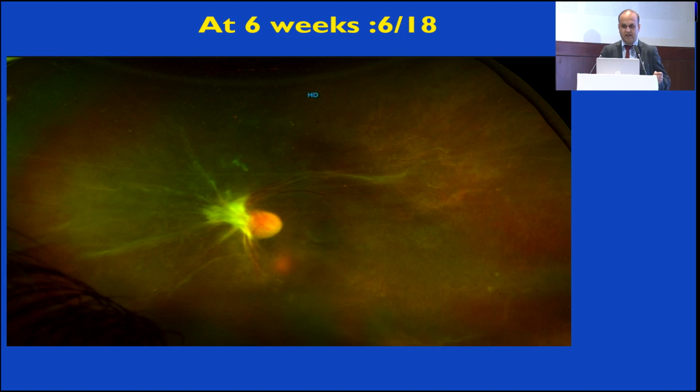So in a nutshell, endoscopy allows for a much earlier intervention in eyes which have opaque media, also helps in removing these foreign bodies, and allows us an opportunity to take care of our patients at a much earlier time than what we could have done if we were waiting for the media to clear.